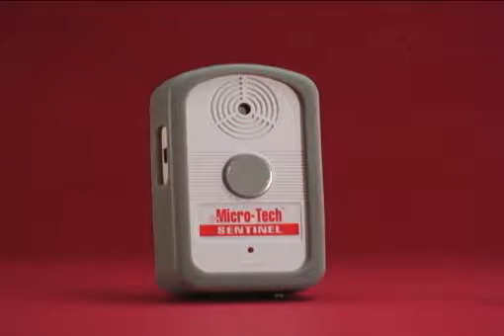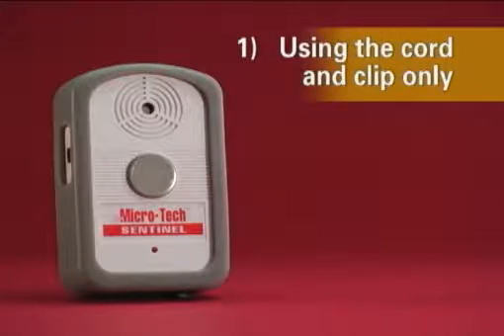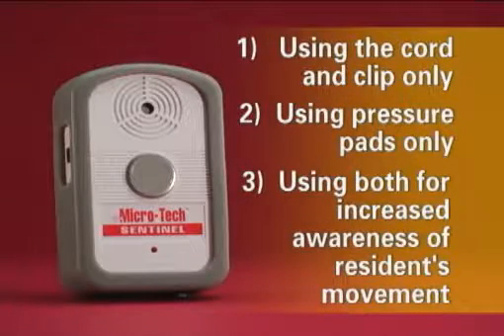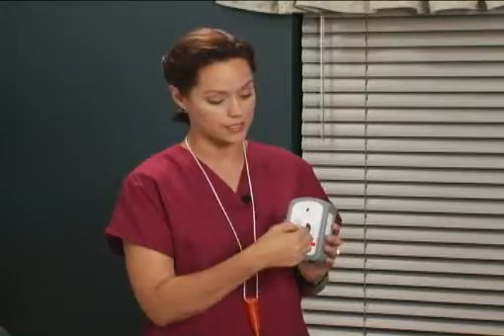This system will allow you to monitor residents in three different ways: one, using the cord with a clip only; two, using pressure pads only; or three, using both for increased awareness of a resident's movement. The cord and clip are attached to the front of the monitor with a magnet. If using pressure pads only, a key fob is provided for alarm reset.